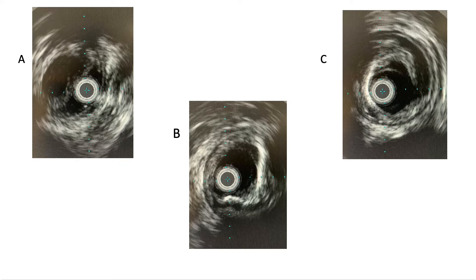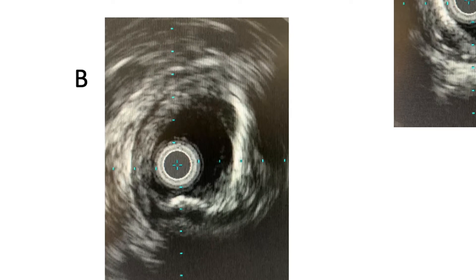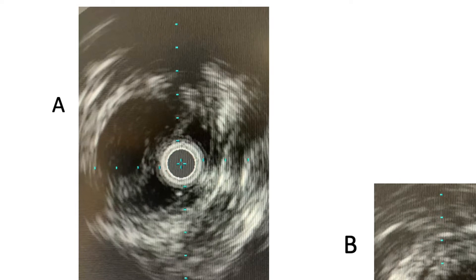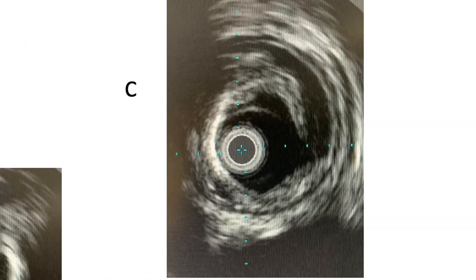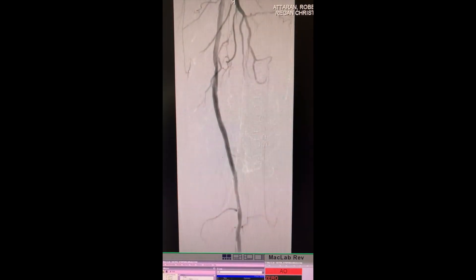Here are some representative IVUS images from our case. You can see plaque within the SFA that needs further pre-dilation. Here you can see that we are sub-intimal adjacent to the true lumen. And here we are true luminal but there is a dissection that needs to be dealt with. We performed aggressive pre-dilation at the re-entry point — you can see evidence of a flap — and we continued further dilations and avoided stenting.